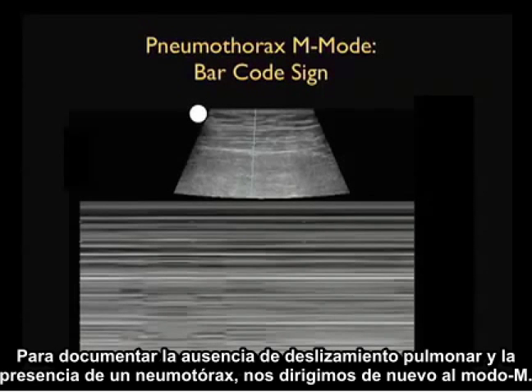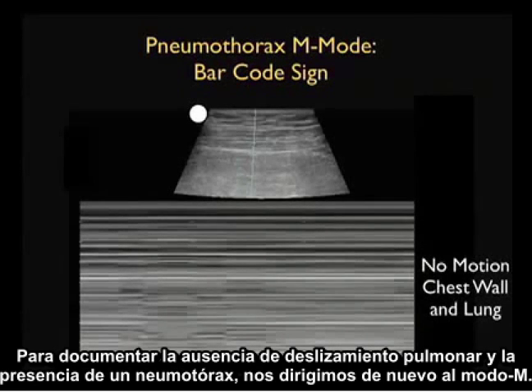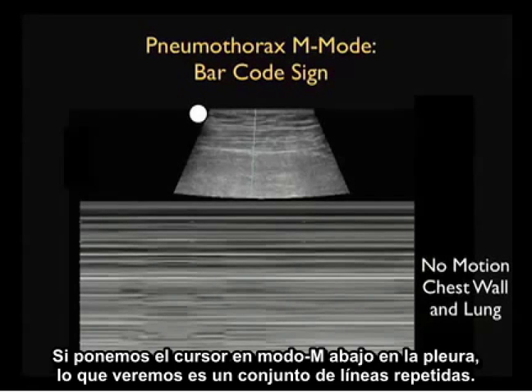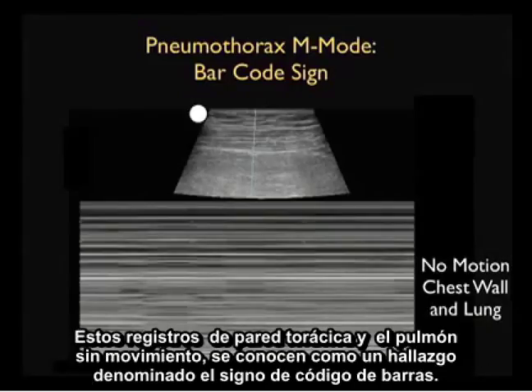To document the absence of lung sliding and the presence of a pneumothorax, we'll again turn to M-mode. If we put the M-mode cursor down on the pleura, what we'll see is a set of linear repeating lines. This documents no motion of both the chest wall and the lung, making up a finding known as the barcode sign.